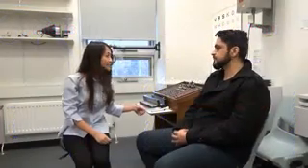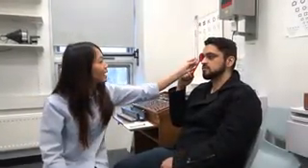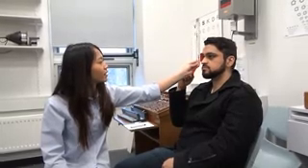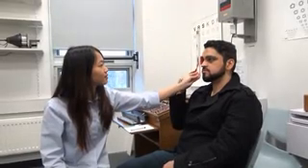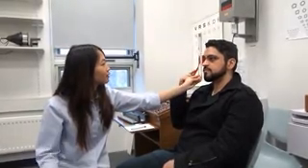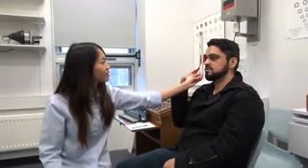So now I'll be conducting this test again, but in distance. So I'm just going to be turning on the light. So where is the light in regards to the vertical red line? It's on the right? Yeah. Okay, so now I'll be putting the prisms against your right eye again, and tell me when the light goes over the red line. Is it getting closer? Yes. So, right now? It's on the line. Okay.